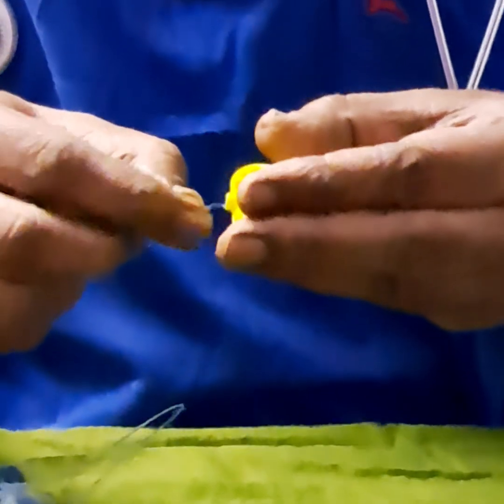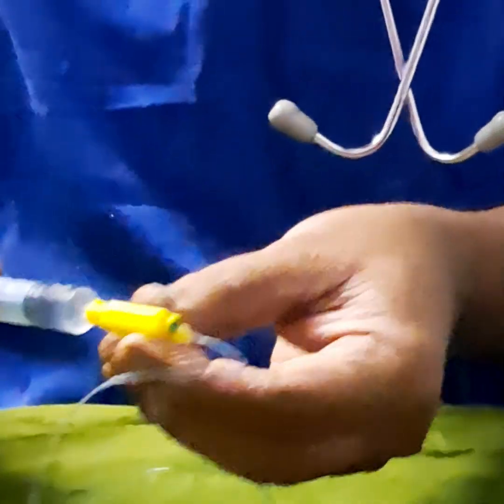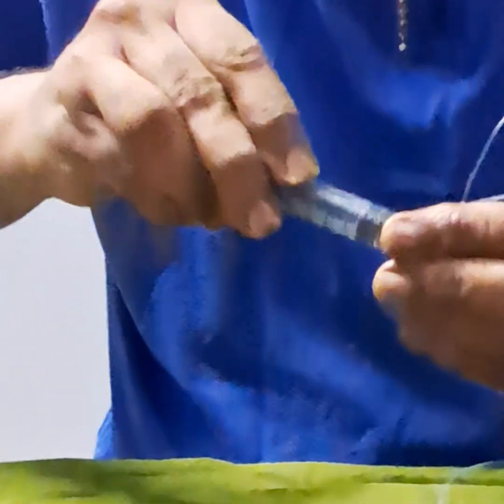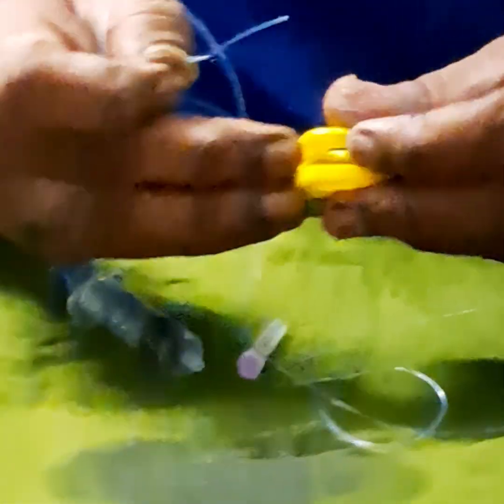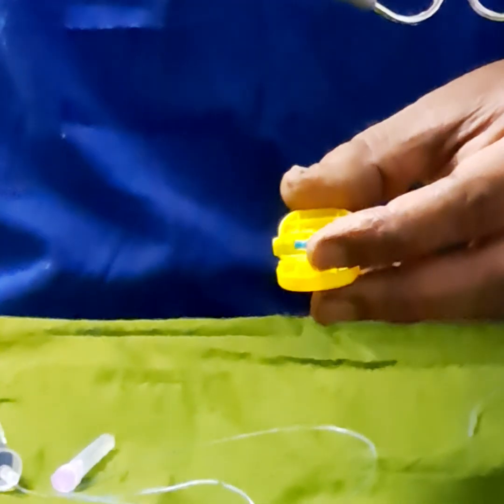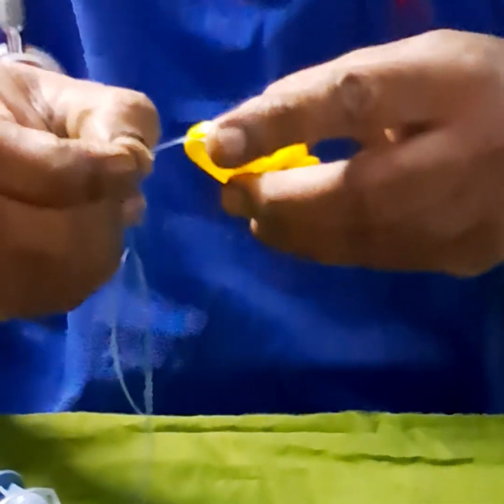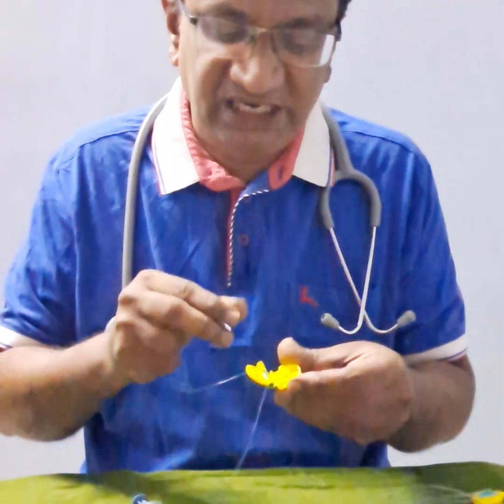If you only insert the catheter partway and close it, the drug will not go — you can see the drug is not going, or going very slowly. This is because the ridges are compressing the tip. If your tip is not distal to the 4th ridge, the compression may compress the tip and the flow will not be there. That is why sometimes if you insert only halfway, you cannot inject the drug.